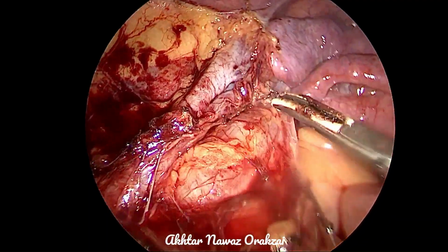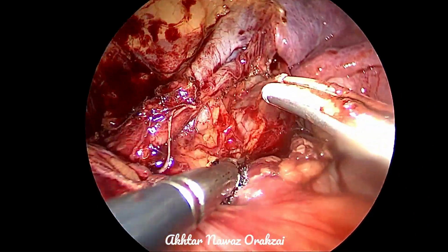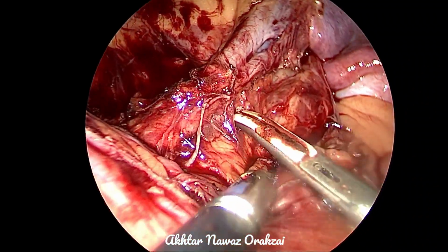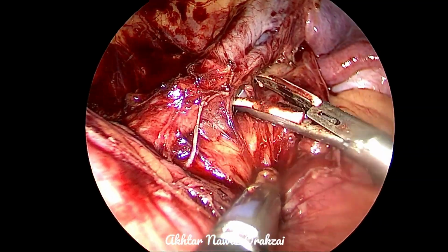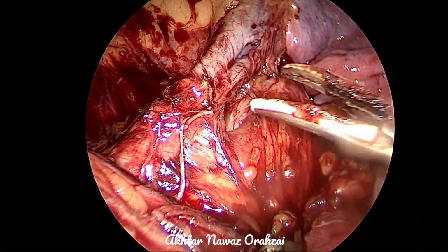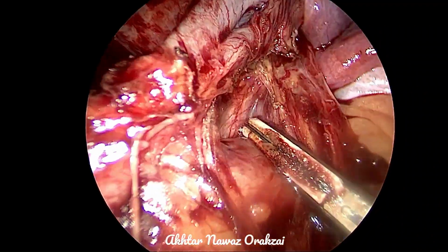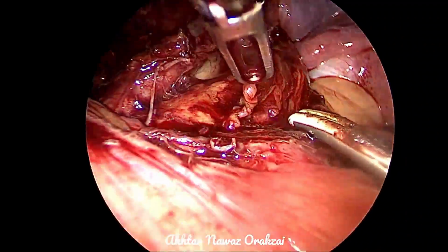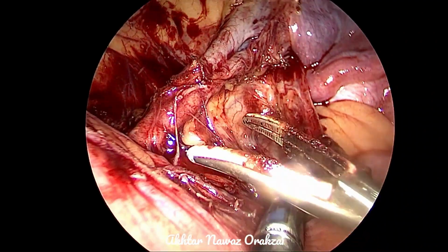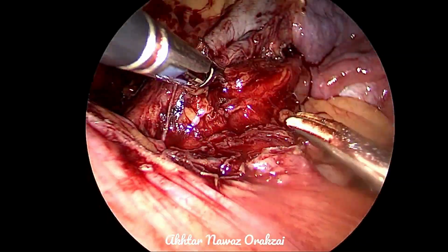The other important thing is that while mobilizing the ureter, one must be aware that the vascularity has to be maintained, because the ureter gets its blood supply from the lateral aspect during its course in the distal portion. This is the internal iliac artery. So it is always good to leave some tissue around the ureter, which is also called the periureteral sheath.